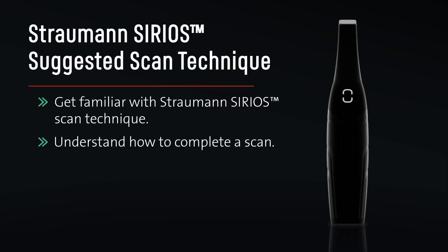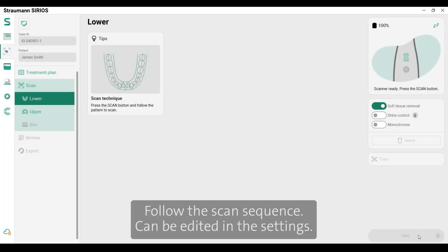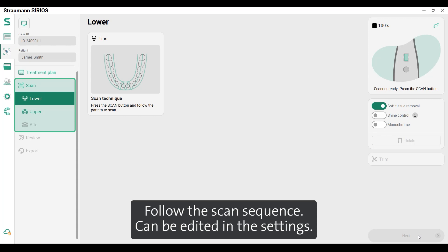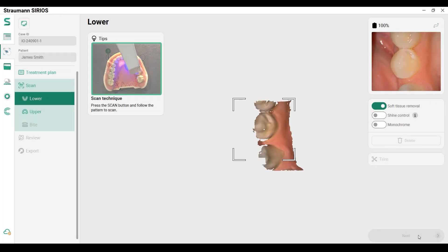Straumann SIRIOS suggested scan technique: get familiar with the Straumann SIRIOS scan technique, understand how to complete a scan, and follow the scan sequences. Scan sequences can be edited in the settings. Start the scanner by clicking the start button on the handpiece.